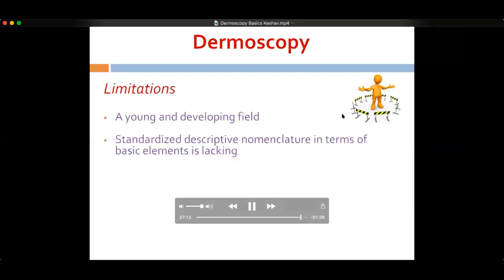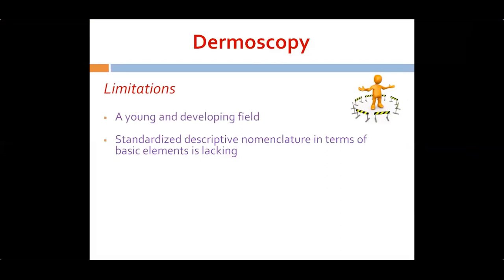Now, what are the limitations? Limitations mainly correspond to the use of dermoscopy in general dermatology, because dermoscopy and dermoscopy criteria are fairly well established in the field of malignancies. In relation to general dermatology, it is still a young and developing field. Many authors use both metaphoric terms and descriptive terms, and some use only descriptive terms.